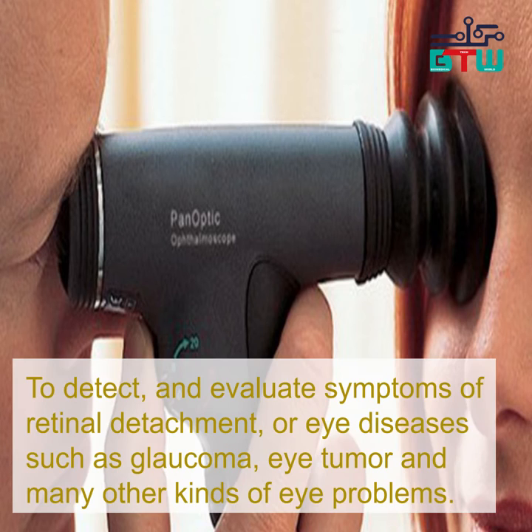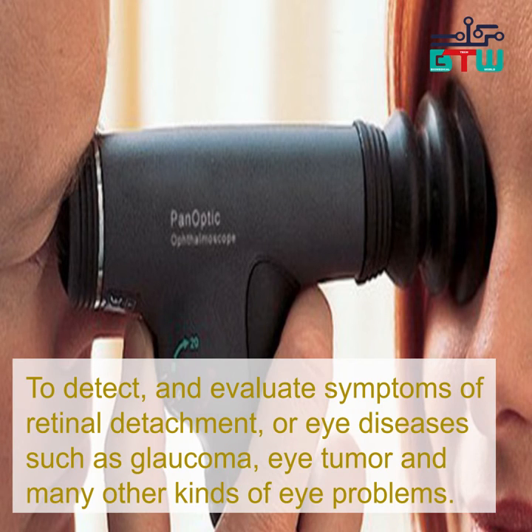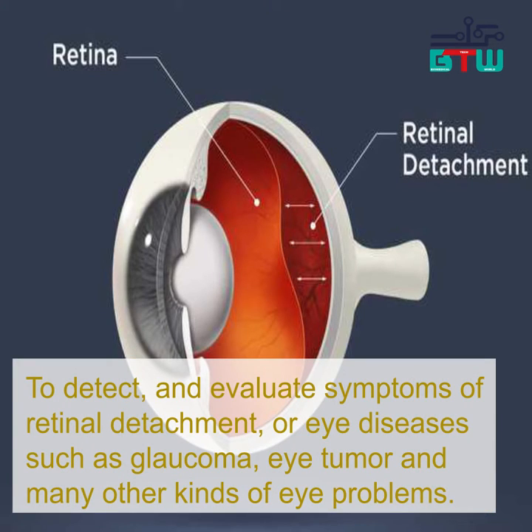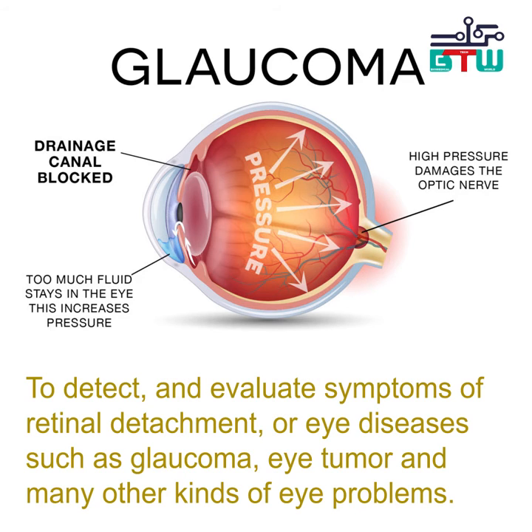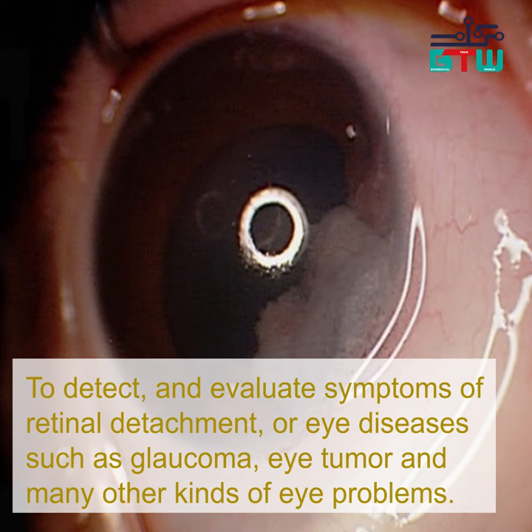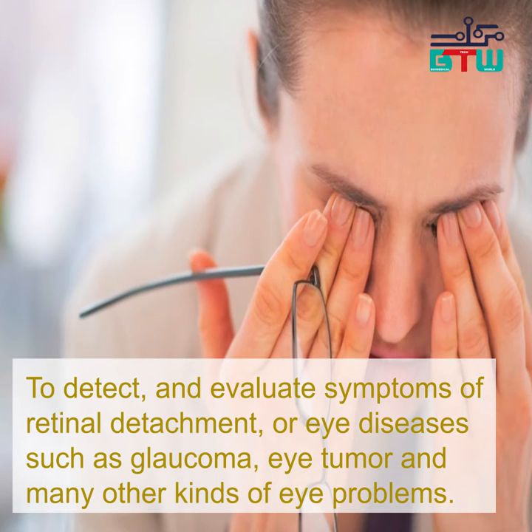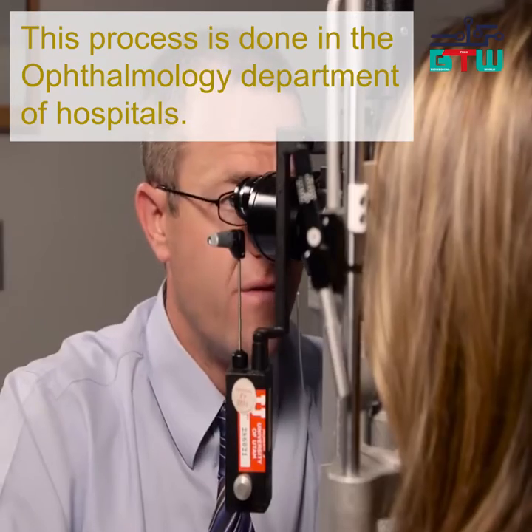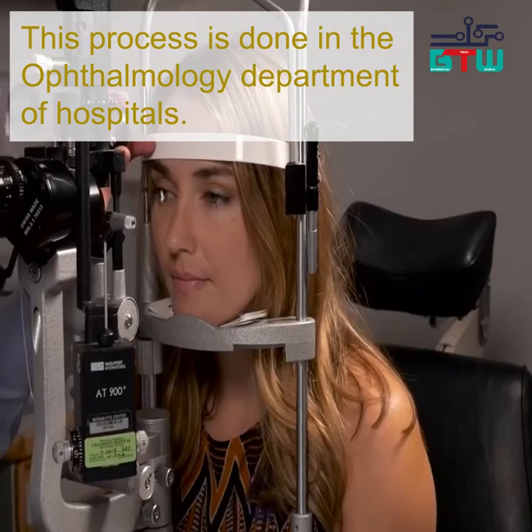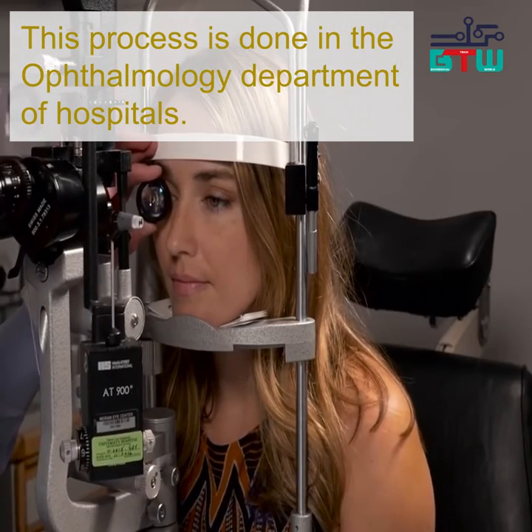The ophthalmoscopy process is done to detect and evaluate symptoms of retinal detachment or eye diseases such as glaucoma, eye tumor, and many other kinds of eye problems. This process is done in the ophthalmology department of hospitals.